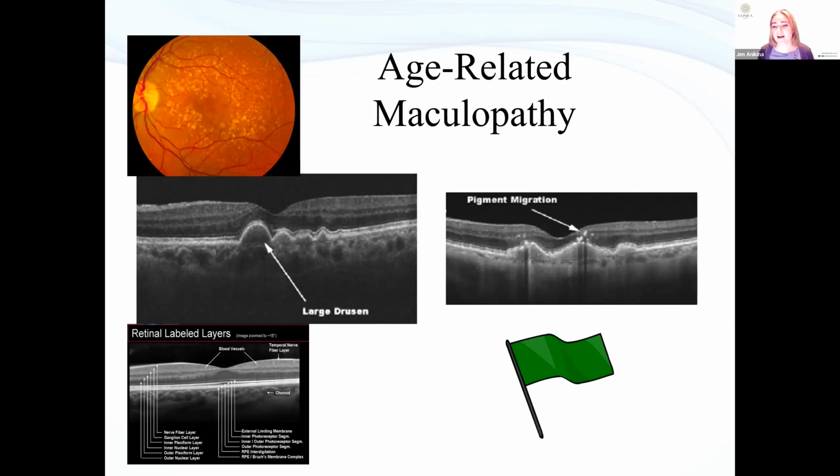Yeah, so again, it's all contextual. You look at the patient, you look at the fundus, you look at the picture and the OCT together, and then you ask yourself the question, is this likely to be clinically significant, visually significant? And to be honest, if in doubt, we don't mind a referral. We don't mind cross-checking because it is so serious. We never mind to double check.